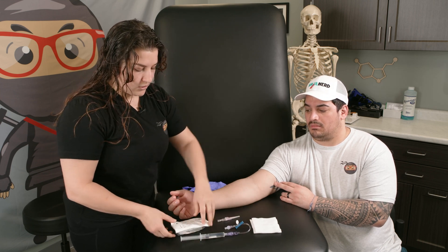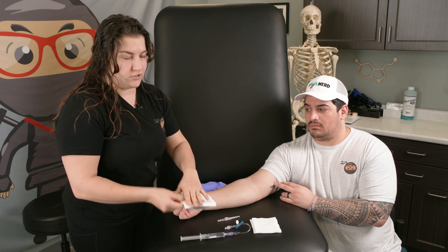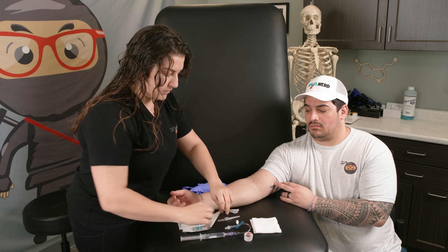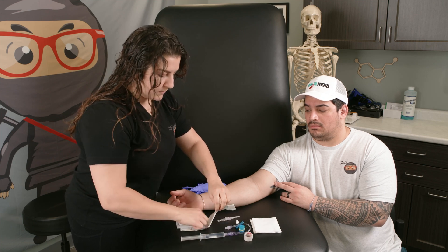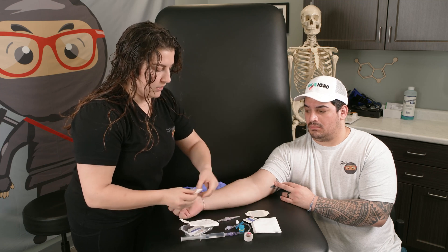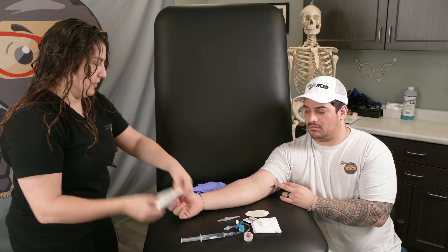We also want to make sure we have our IV catheter. Lots of places have IV start kits. In our IV start kit we'll have some tape, our tourniquet, some alcohol prep, and we'll also have our tegaderm, which is going to help us secure our IV.